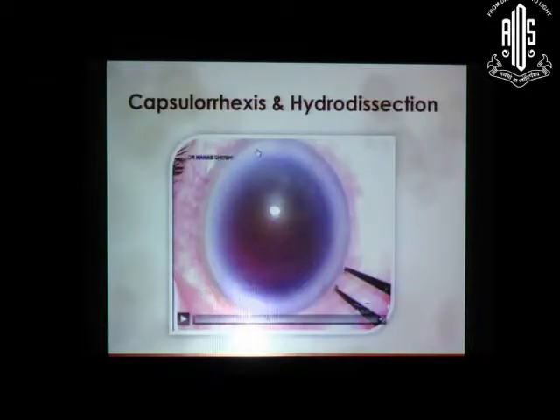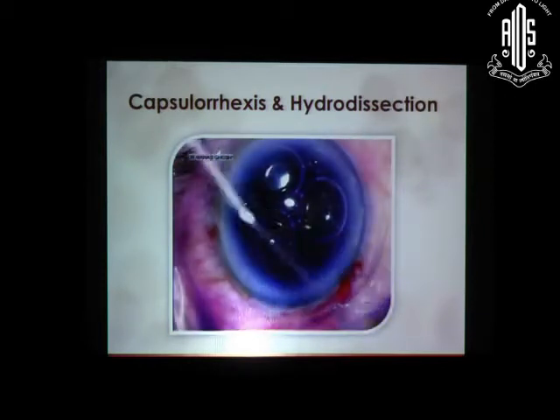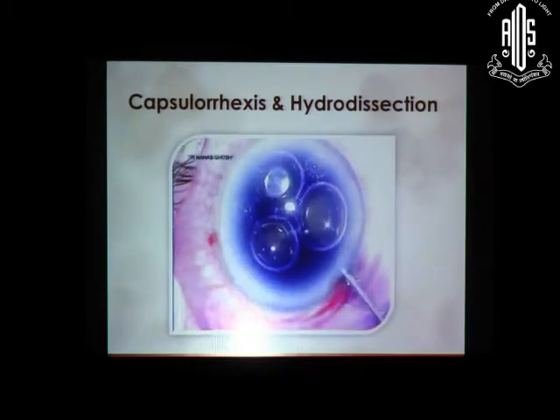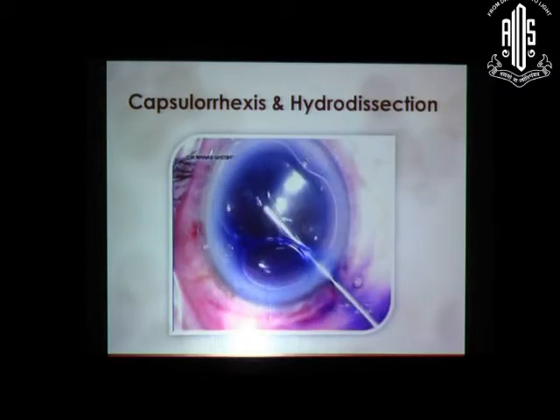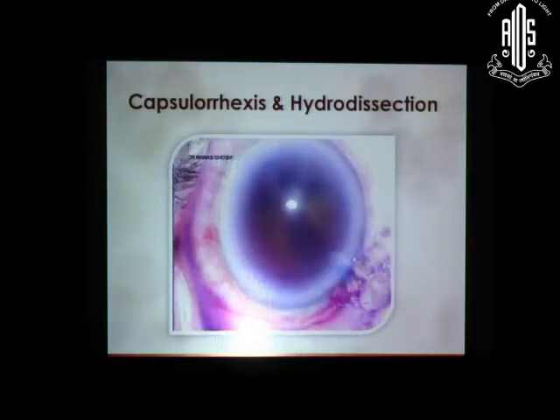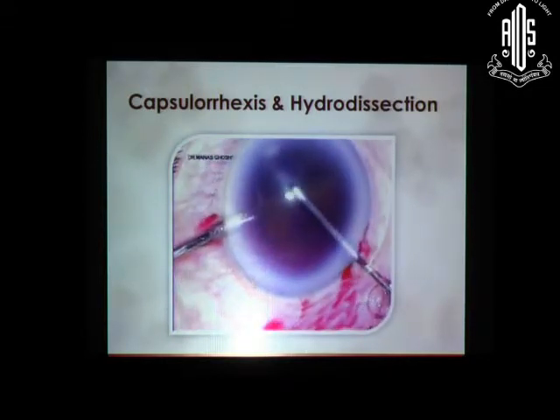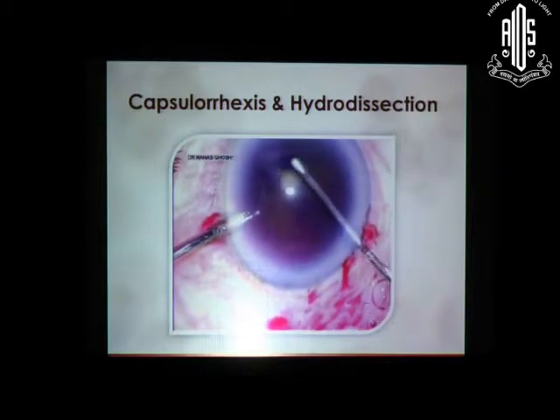The next part, after anesthesia and incision, is the capsulorhexis. Capsulorhexis is the most important stage. Trypan blue staining helps in visualization of the anterior capsule throughout the procedure. We prefer to use the soft shell technique in all of our hard cataract cases. So first we use Discovisc, then HPMC.